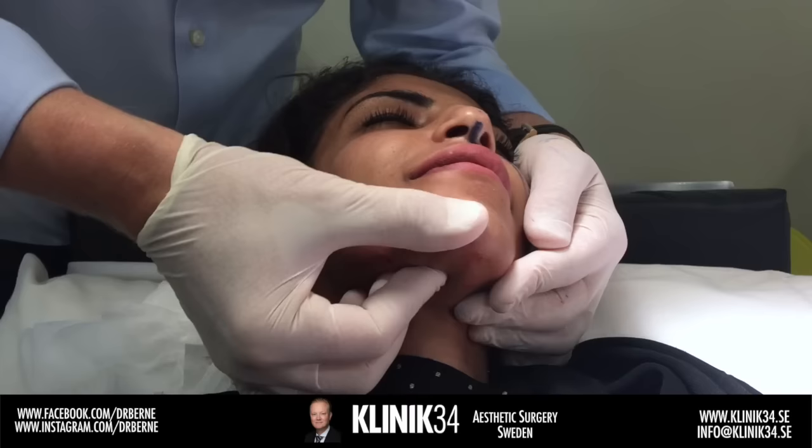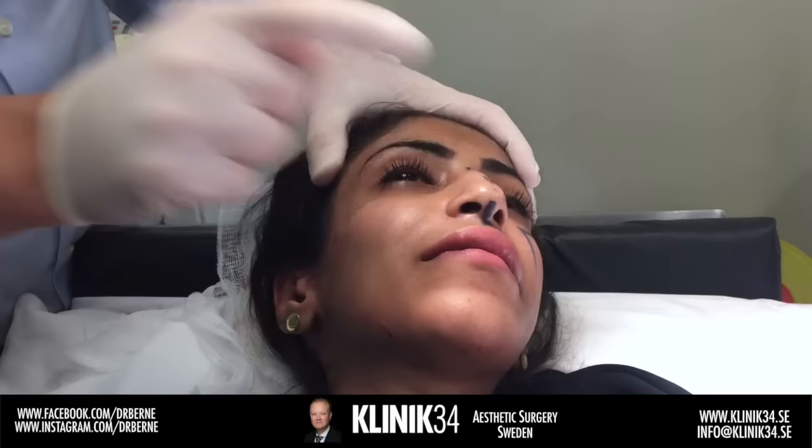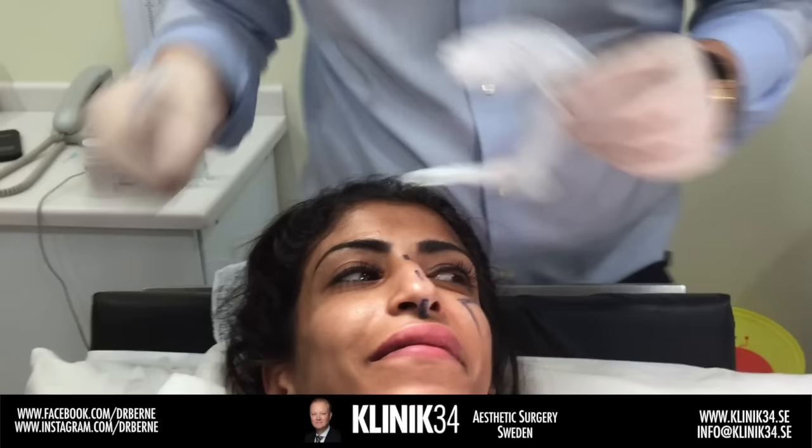Having support of the chin, we need to do that on the other side as well. The projection is getting there — now we need to fix the nose.